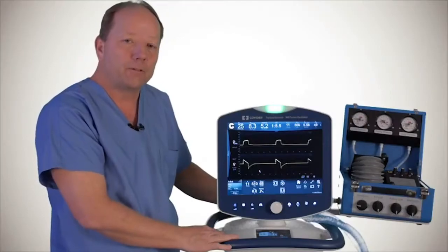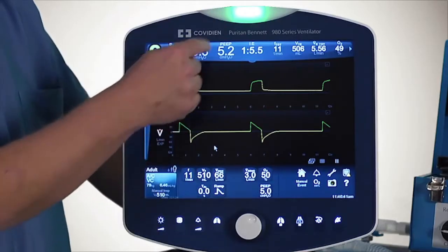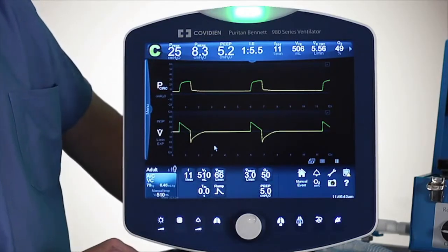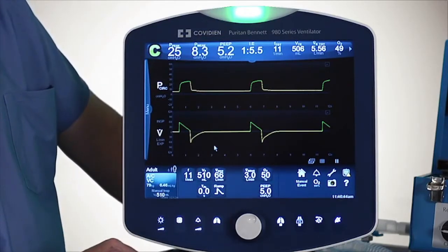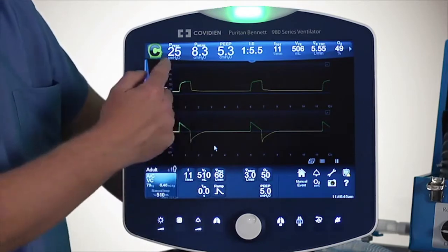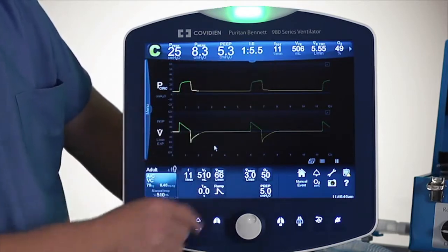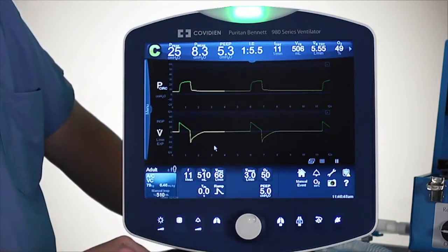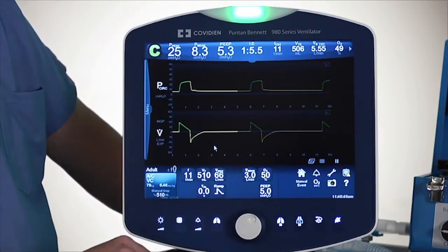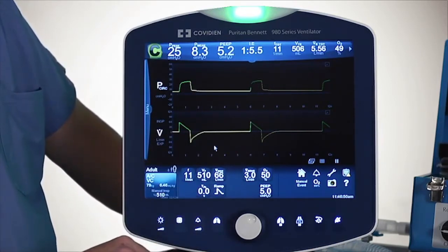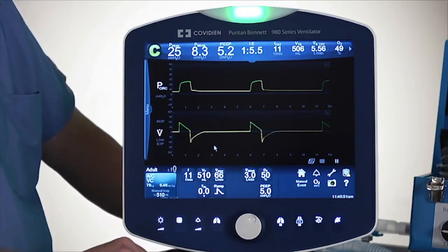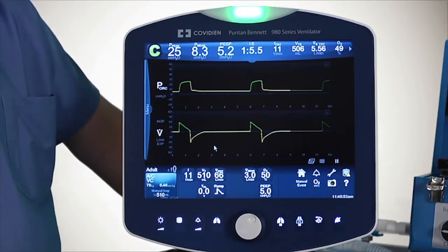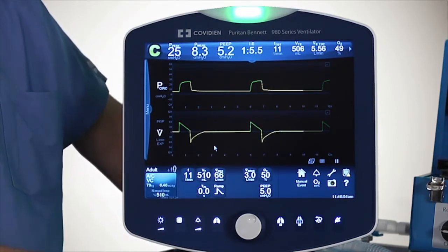I'm going to move up to the patient vital data area on the top screen. This may look very familiar if you have an 840 ventilator in terms of some of the information, but now we have some enhanced customization that you can do.